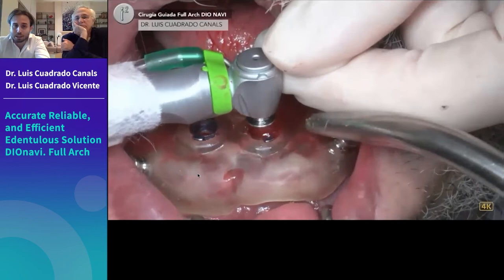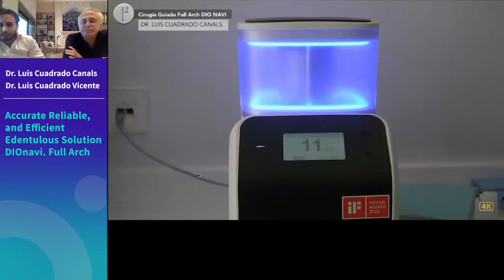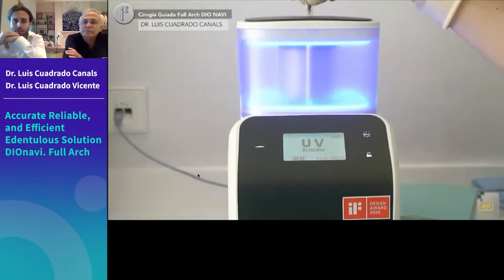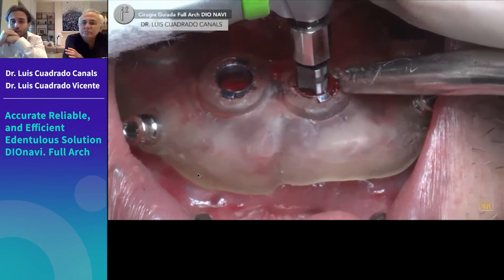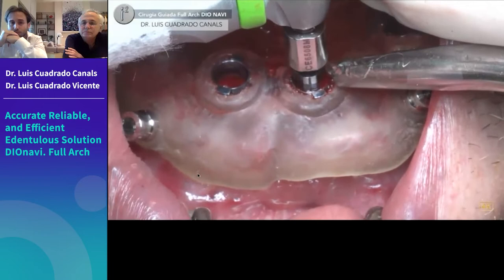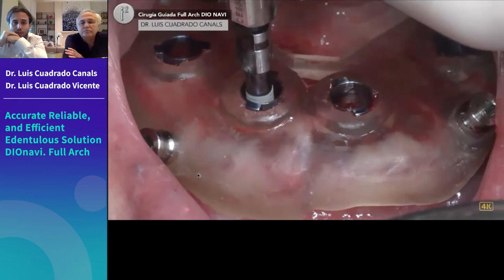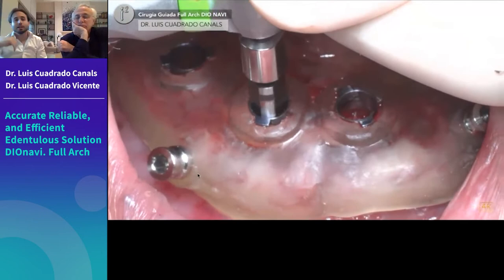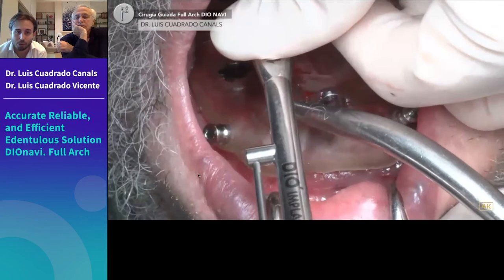The profile drill is one of the most important drills — it ensures the multi-unit abutment and provisional cylinders insert perfectly. After placing the implants — the anterior ones were 3.8×13mm — those with 10.5mm offset required the drill to reach the second mark. Always prefer to finish the last millimeter manually for greater precision on implant height.